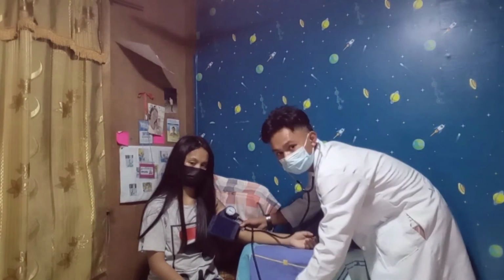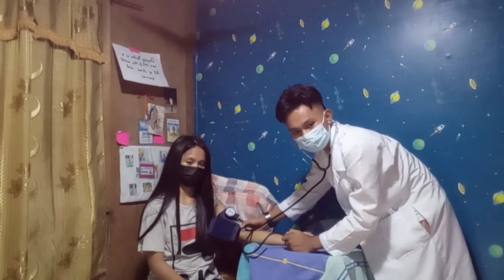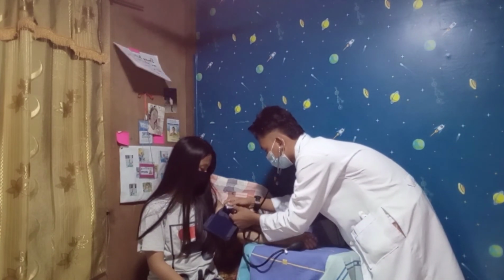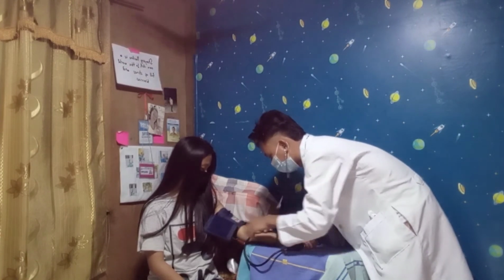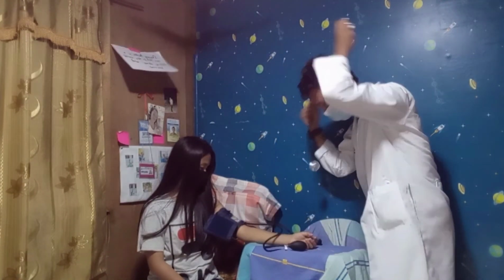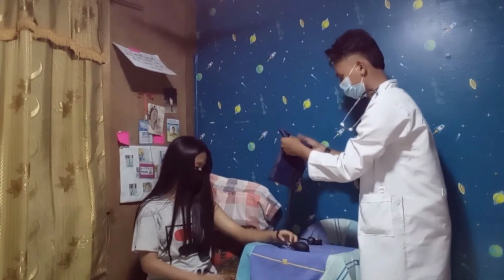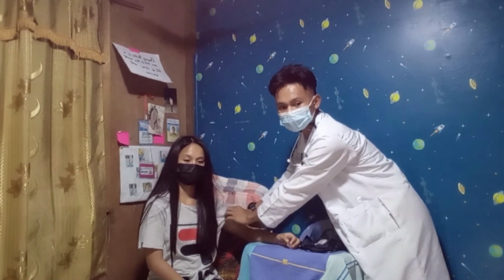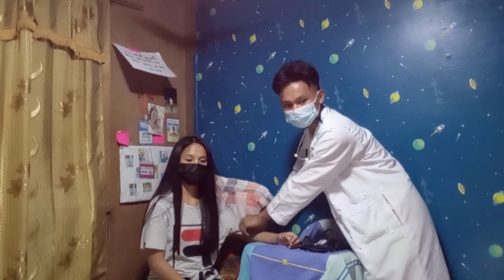Remove the cuff from the patient's arm and assist the patient to assume a comfortable position. Cover the upper arm that was previously exposed. Discuss the findings with the client and do health teaching as needed.